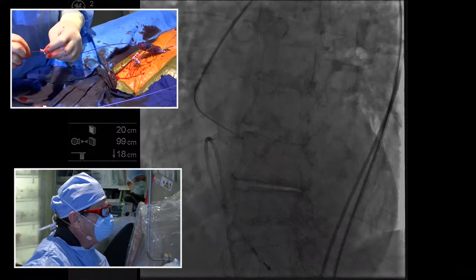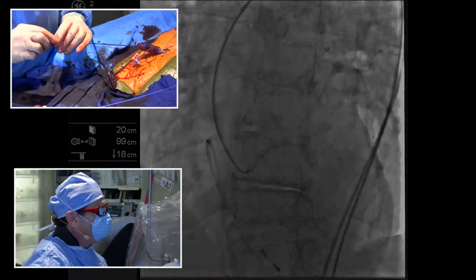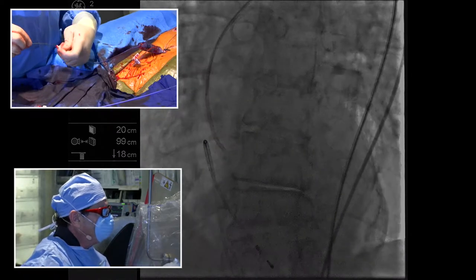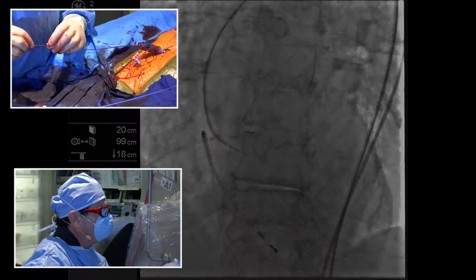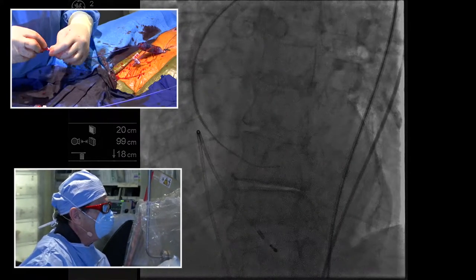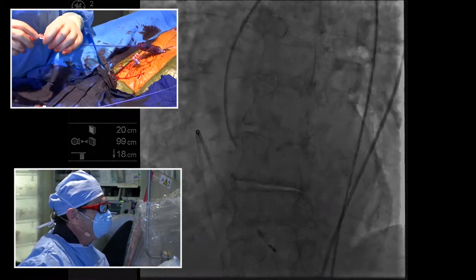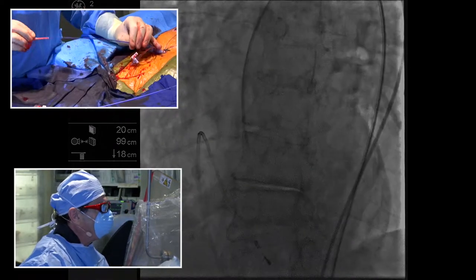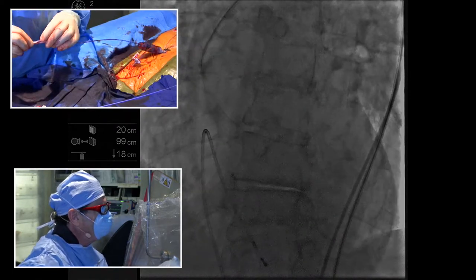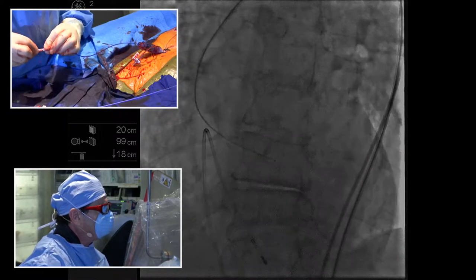This feels like it's going the wrong way. Tight valve. It also feels like I can't get to the left side much with this thing. But it's different. So we'll try an AL2. I mean, there is a channel here, so I should be able to find it, right? So you see how this catheter is shaped differently, which gets me to do different things, but it's just not letting me do what I want to do here. Okay. It's just not getting me across.